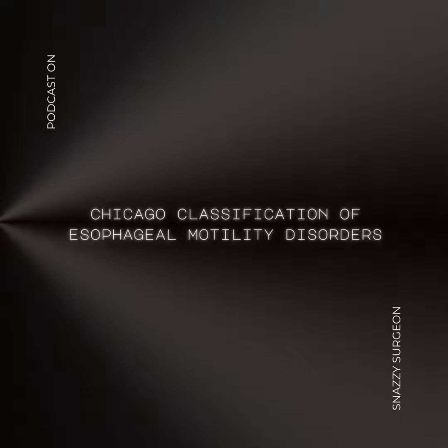What about type 2 achalasia? Type 2 also has the high IRP and the 100% failed peristalsis. But here, the key difference is that we see panesophageal pressurization in at least 20% of the swallows. So even though there's no organized contraction, there is some pressure building up throughout the esophagus. I see. So some pressure, but still no effective movement.